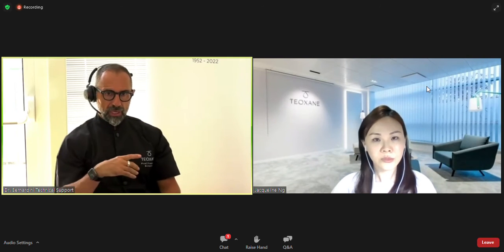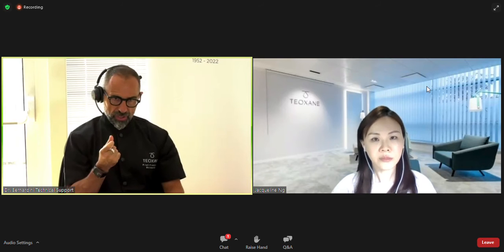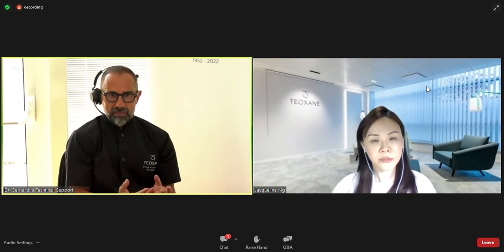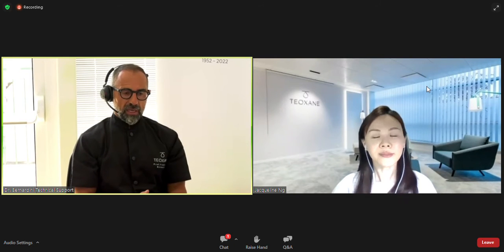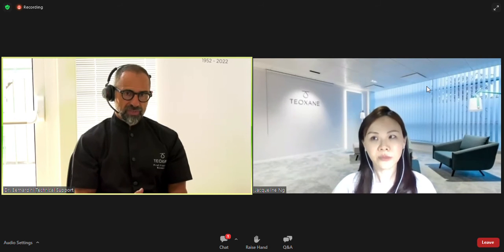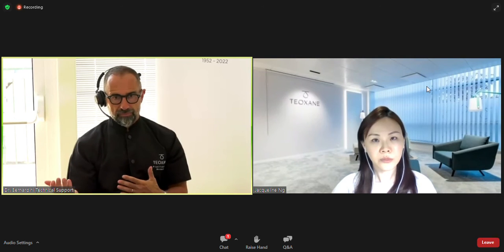There's no point in using a shorter one, as with the longer there is even the short distance. I like the longest. And the 25 has been the right size as for safety and as for pain.